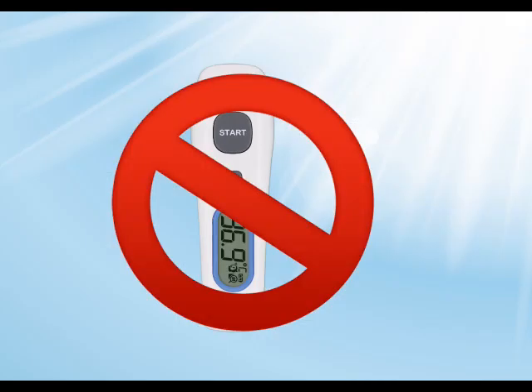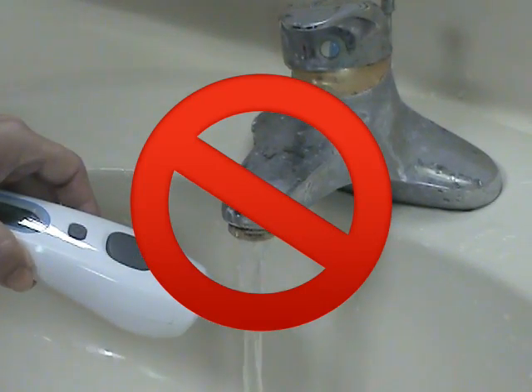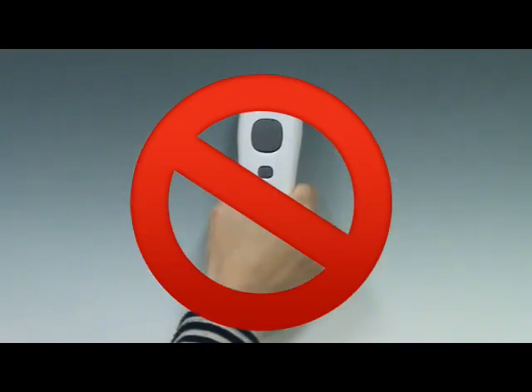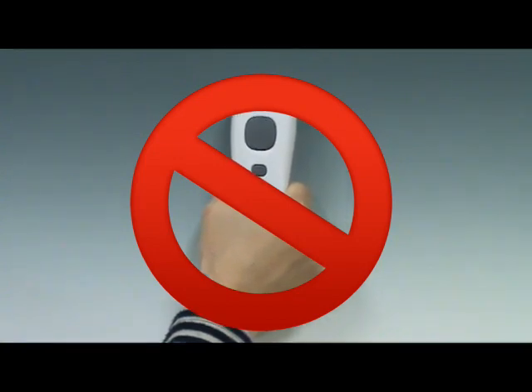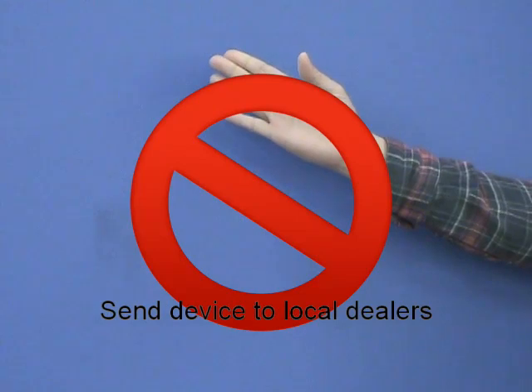Keep the unit dry and away from direct sunlight. Do not submerge the thermometer in any liquids. Holding the thermometer too long may cause a higher ambient temperature reading of the probe, which could make the measurement lower than usual. Please check if the thermometer is damaged if it falls. If you are unsure, send the device to your local dealer for service.